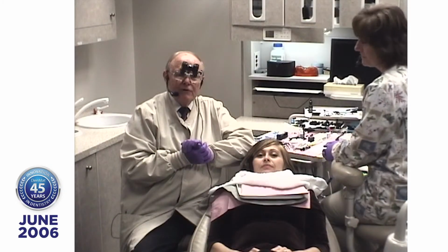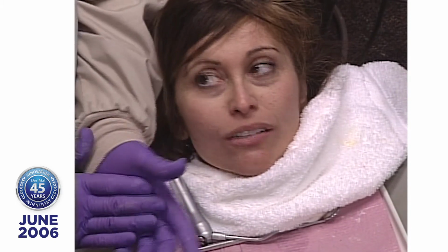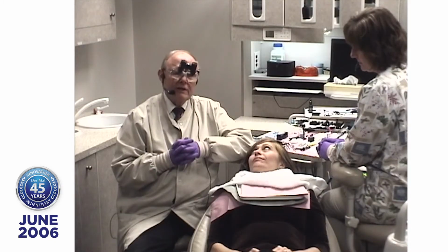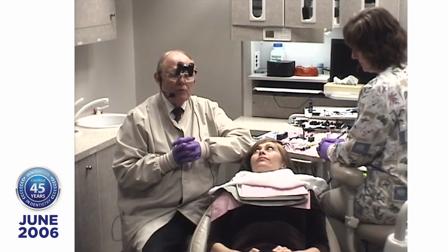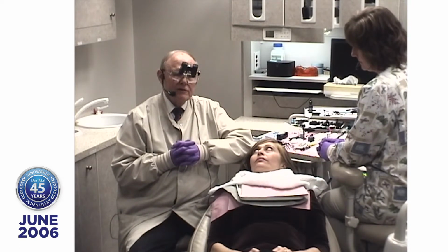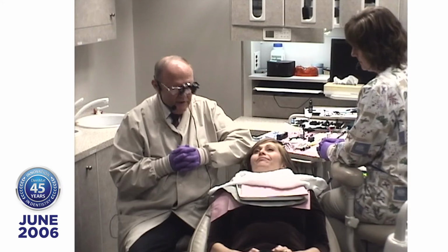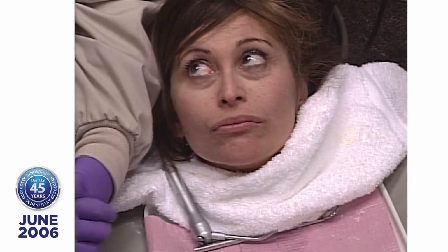It's nice to be with you folks, virtually, so to speak. This patient is going to be particularly interesting. She's a very good patient. She has a severe case of tetracycline stain. She didn't want her teeth ground down, but she has had some patchwork done in the past. So she's from where? San Francisco? That's right. And she came down here because she wanted to get an attractive smile.